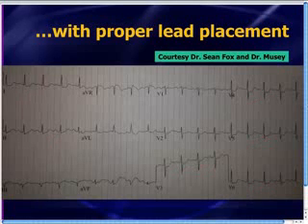But there's a big difference between calling something diffuse ischemia versus calling something STEMI. With STEMI, if it's 2 o'clock in the morning, you're waking up the cath team or you're giving lytics. With diffuse ischemia, you're treating the patient with anti-anginal drugs, your nitrates and your antiplatelet agents and all those other things. So there's a big difference here. And the last thing you want to do is to call the cath team in only to be embarrassed because you got a 12 lead which had lead misplacement.